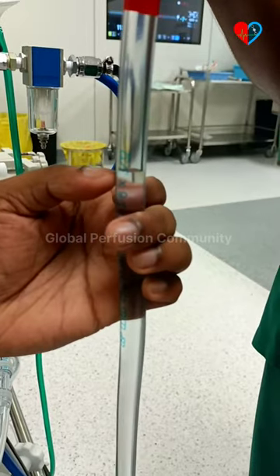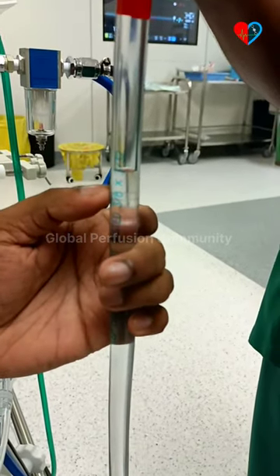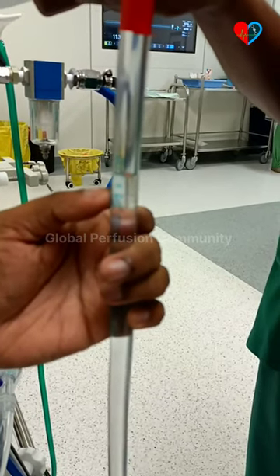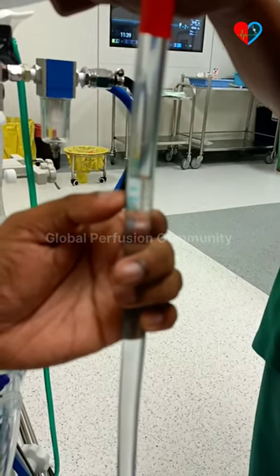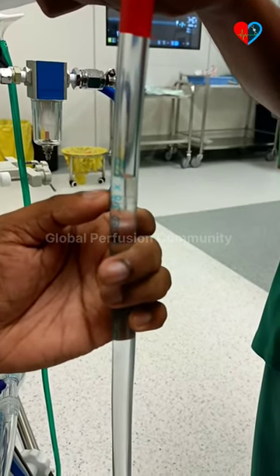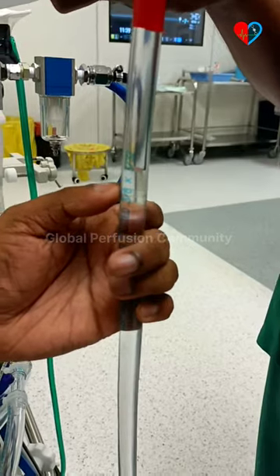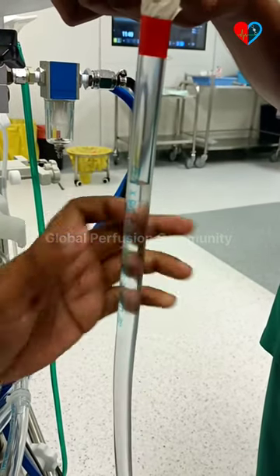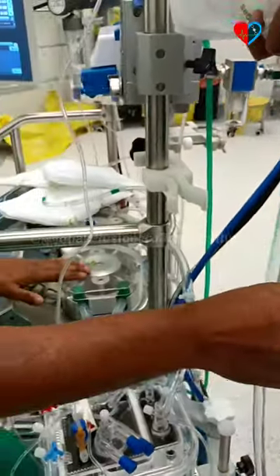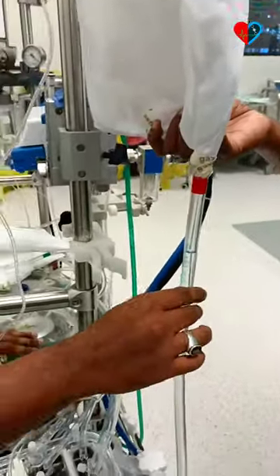Again we are checking the fall of the fluid. That is an adequate fall in the fluid. The height should be 30 centimeters above the roller. This is how we check occlusion using the fluid roller method.